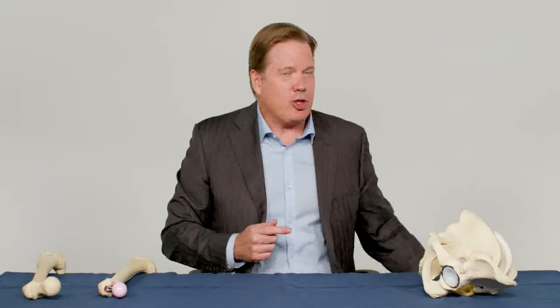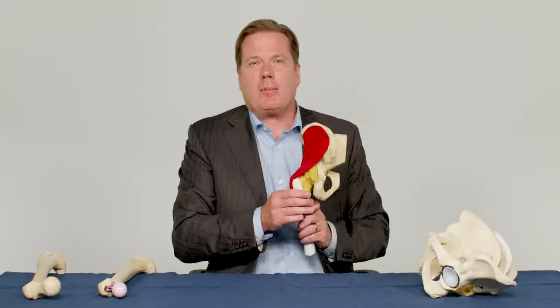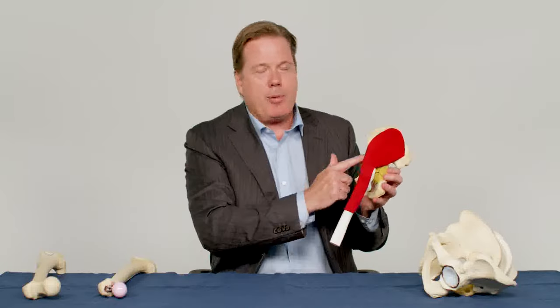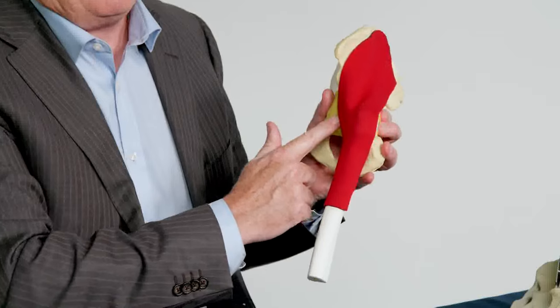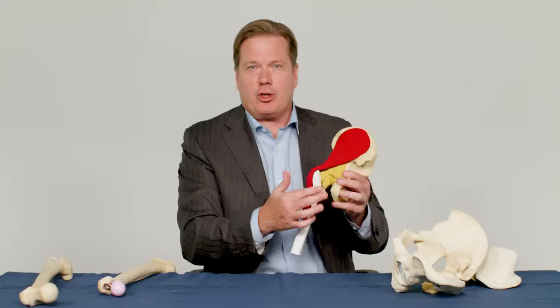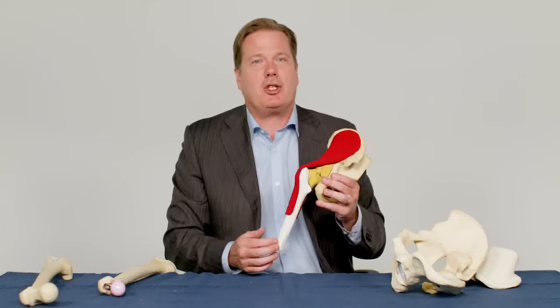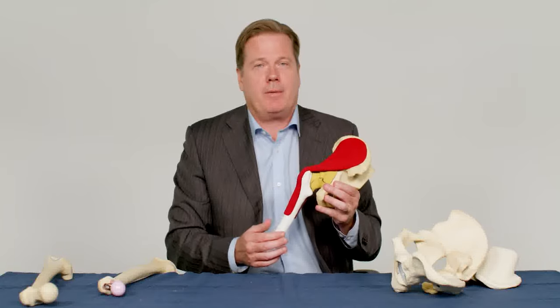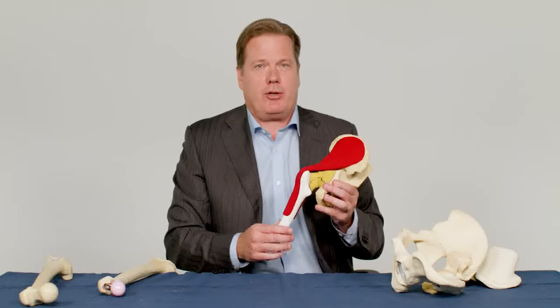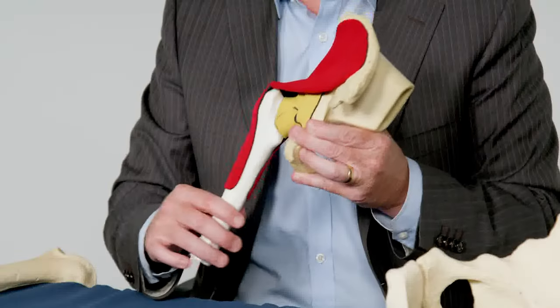Hip replacement surgeries are most commonly performed through either an anterior, a lateral, or a posterior approach, all relative to the gluteus medius or abductor muscle. The surgical approach affects how the patient is positioned during the surgery and what kind of precautions or movement restrictions the patient must follow after surgery.